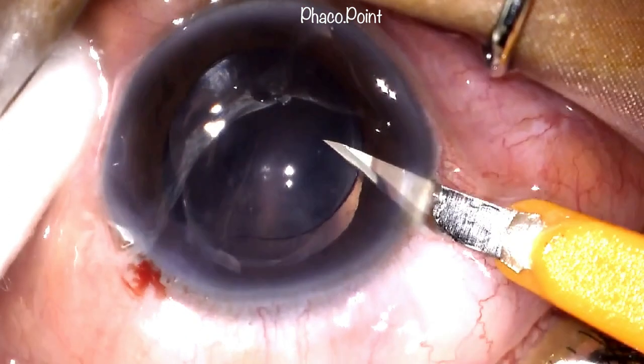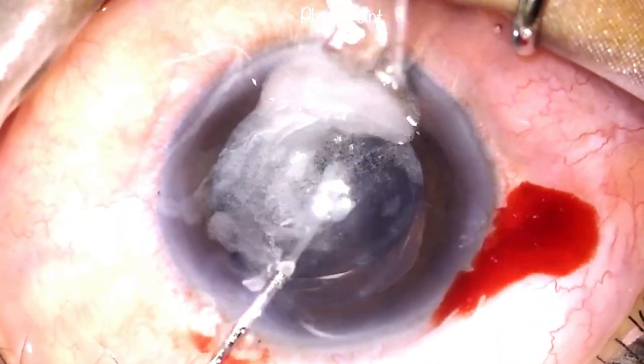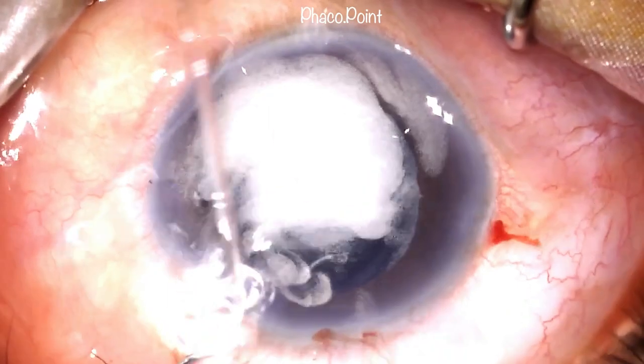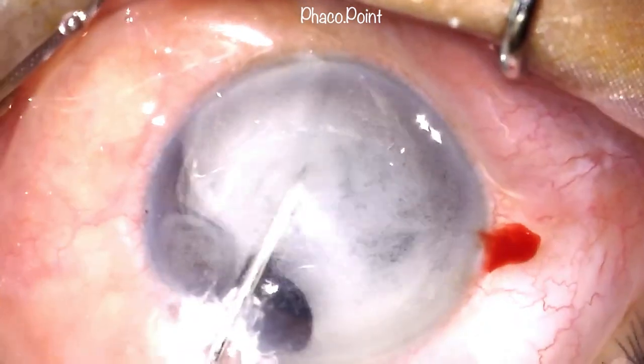The incisions are always wide enough to allow for a vitrector and are placed at such a position that will allow for the ease of insertion of the anterior vitrectomy instruments. We then proceed to the intracameral injection of diluted triamcinolone to delineate the disturbed vitreous.